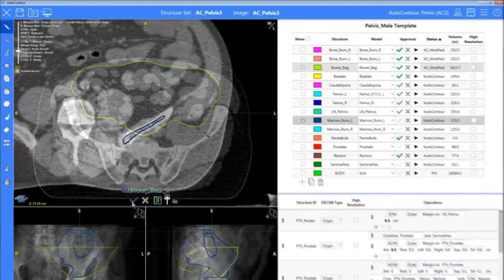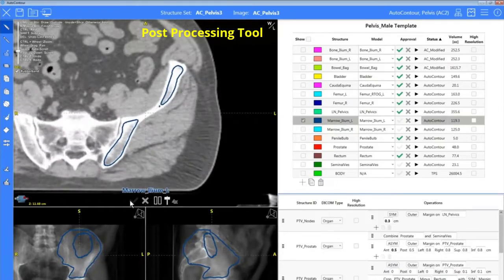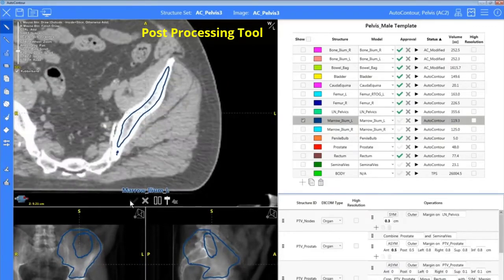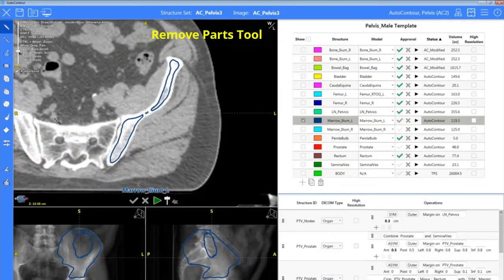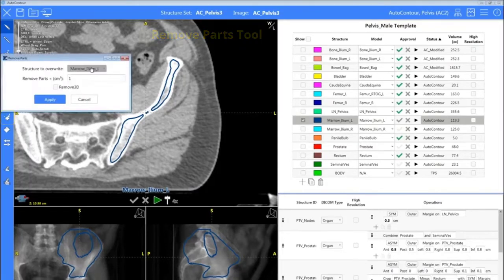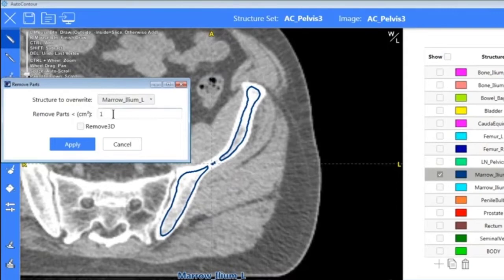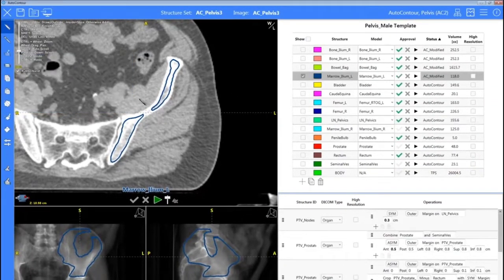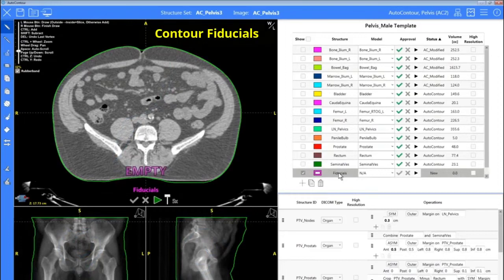On to another new structure — our ilium marrow — which I really like to use our post-processing tools on. Here's where we can use that remove parts tool. We want to make sure our structure is selected at the top. We can adjust our size and also remove in 3D. I'll hit apply here, and we can see our contours cleaned up for us.